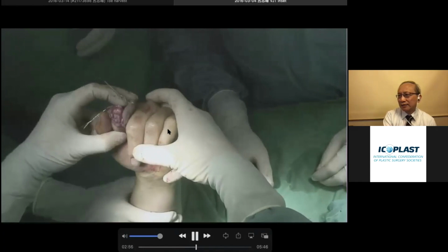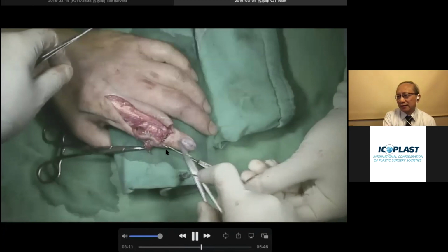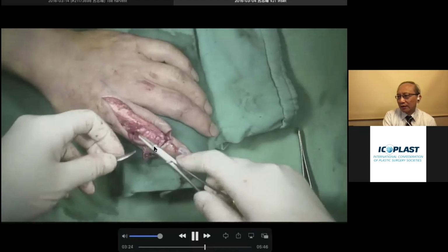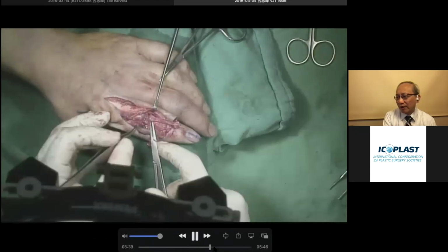Okay, then we suture. Now I'm repairing the periosteum. So that will just cover the circlage wires so that it will not expose or irritate the extensor tendon later. Okay, so suture the periosteum at the distal, and then now I'm tying down the 4-0 Prolene, so that the lateral bands actually attach to the periosteum tightly, so that it makes the insertion on the middle phalanx. Then suture the periosteum at the proximal phalanx level.